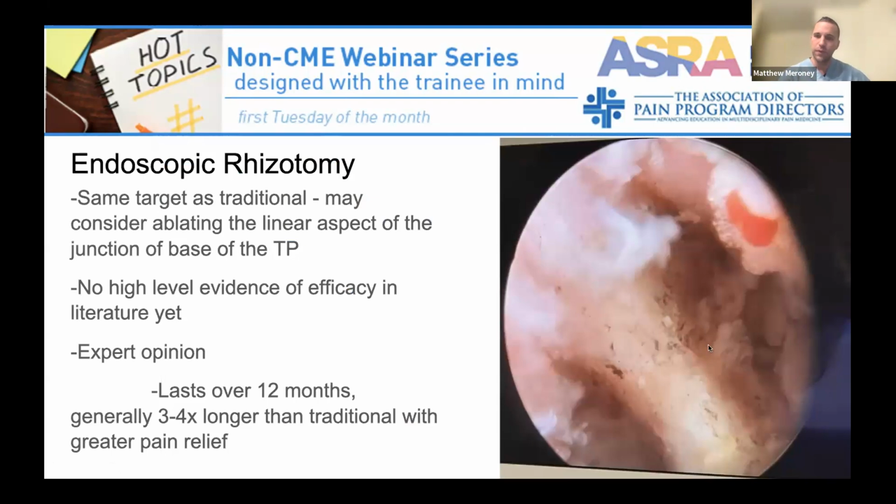Here's a view of one of our patients. That being said, I did a more aggressive, I would say, ablation on this patient. I likely did get the intermediate and lateral branch. Actually, I think this is on a cadaver. I really wouldn't want to expose this whole thing. I'd want to just be at the junction of the transverse process, on the proximal end. If this was a live patient, I'd be denervating some other muscles, though this is what one transverse process will look like.